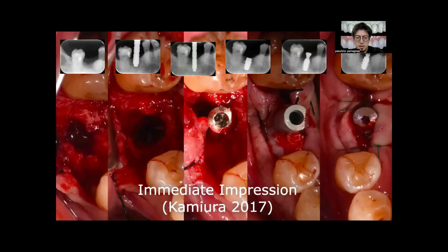Next is a case where the custom abutment was used as a healing cap. A digital impression is taken at the time of implant placement, and the custom abutment is fabricated and installed on the same day. PEEK milling is possible in about an hour.